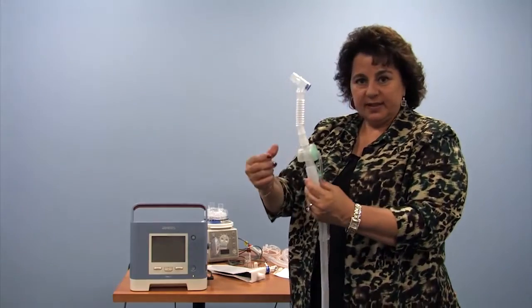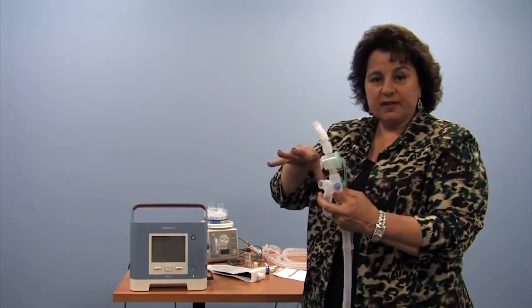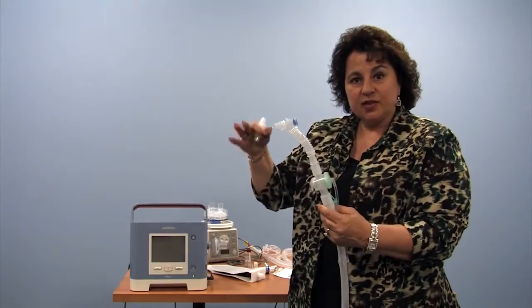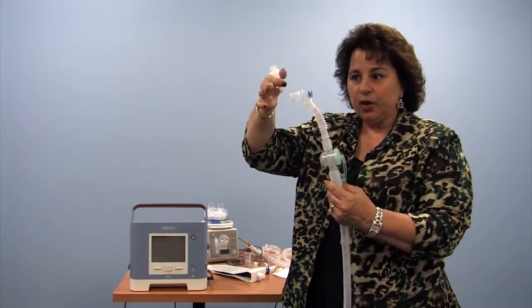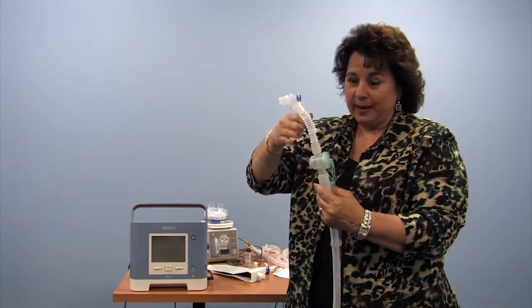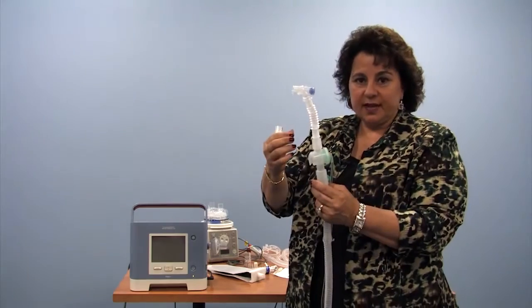This would be an adult type adapter because it's larger and longer. This would be a pediatric adapter. And please do discuss this with your physicians, your respiratory therapist, about which is best for your child. It depends on the size of the child and the size of their breaths. If we put a really large piece here, if here's where the child is and here's where the fresh gas is, the child has to rebreathe this air, which is sort of like breathing through a paper bag. So small babies with small sizes of their breaths, we use small pieces, and larger patients have the flexibility.